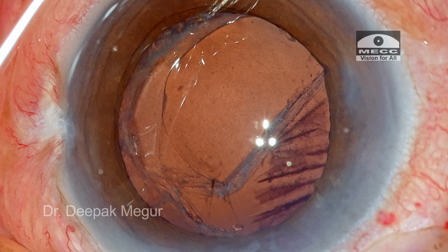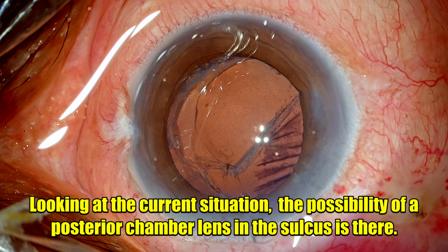Now, under retroillumination, I can delineate the rhexis margin, which is the outer ring here, and the well-defined inner margin is that of the posterior capsular tear. It's eccentric. Some part of it is within the pupillary area, and the majority of it is outside the pupillary area. But looking at this picture, I'm quite hopeful that a posterior chamber lens in the sulcus is a possibility.